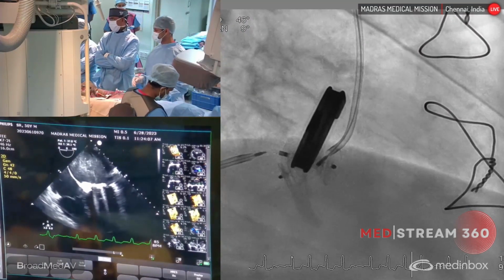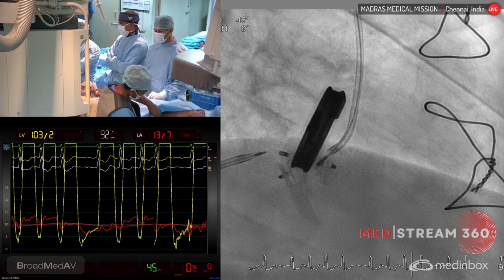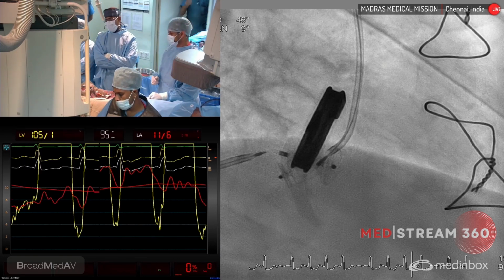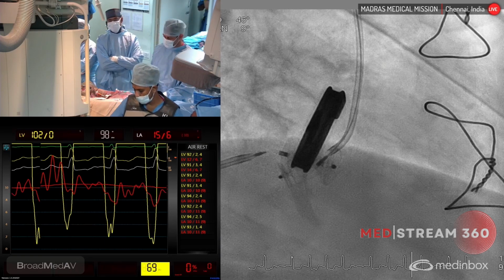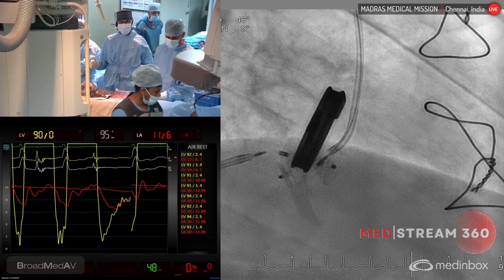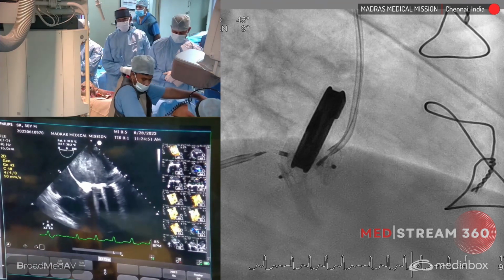Actually, the left atrial pressure has come down from the starting of the procedure, somewhere around 15 millimeters of mercury, now to around 10 millimeters of mercury. Put it on 10 scale. Now we are able to see that there is hardly any transmitral gradient. Let's get an electrical cardioversion, 200 joules single shock synchronized, and give a broad vector, Prabhu. We can keep the sternal paddle beyond the right mammary region and that one towards the apex.